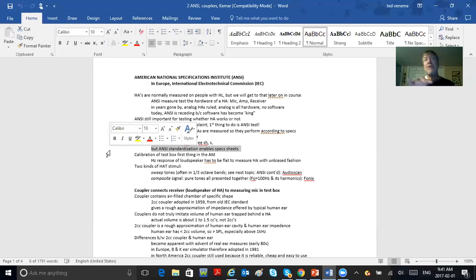What's the reference test gain? What's the full-on gain? What's the equivalent input noise? What's harmonic distortion? Okay, we're going to look at those because we should. And if you've forgotten them, the purpose of this session today is to refresh your memory of those because they shouldn't be forgotten.